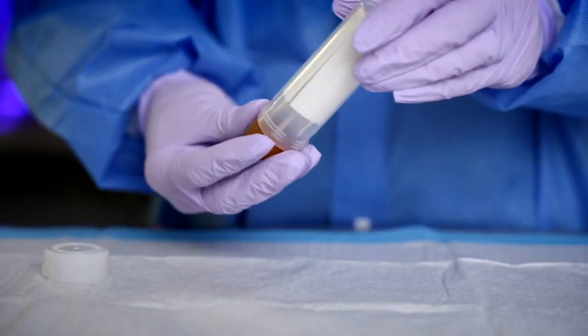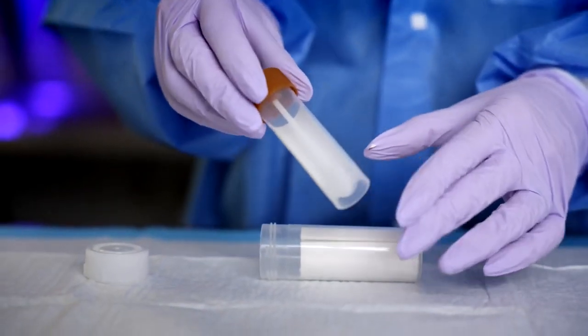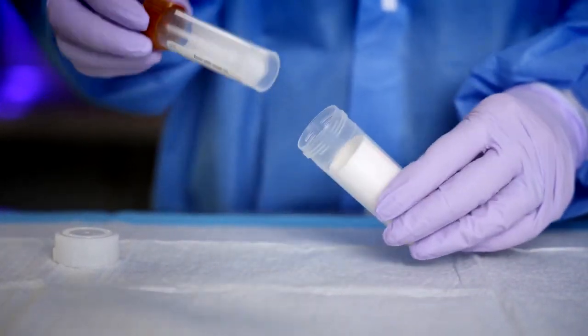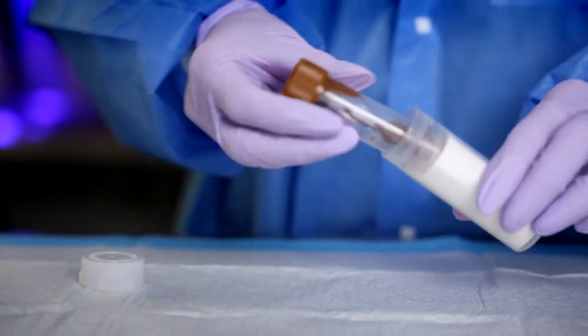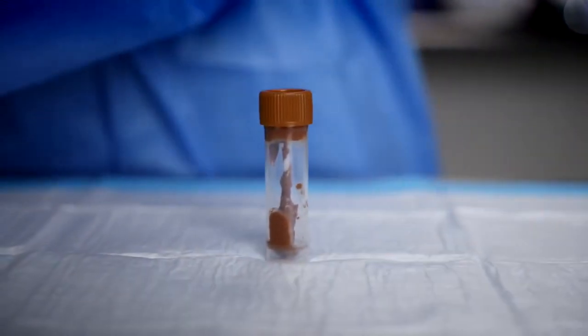Samples can arrive to the lab in many different containers and as stool is not sterile, it does not need to be received in a sterile container. It does, however, need to be a clean container — by that I mean without any additives or fixative. As with all biological samples, stool samples need to be treated with universal precautions.